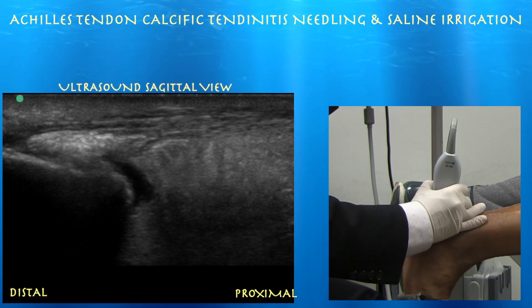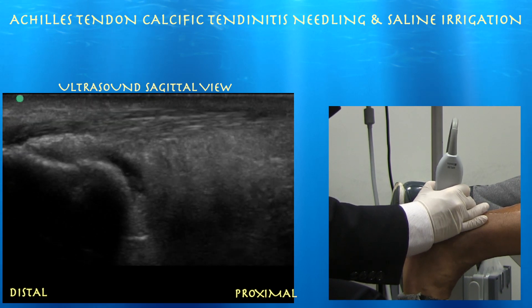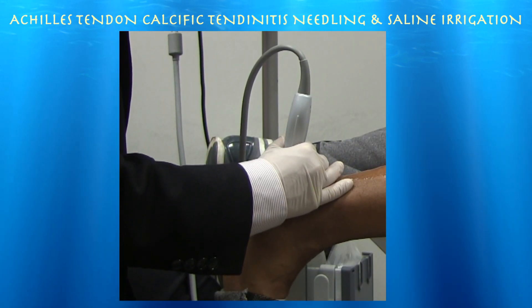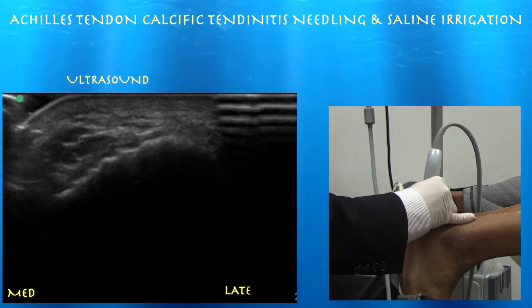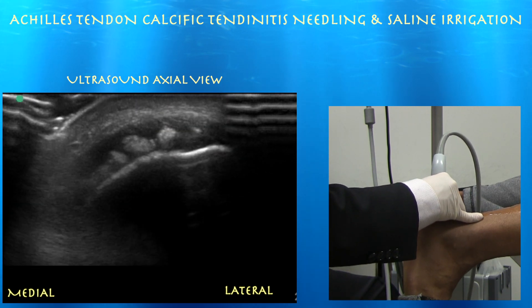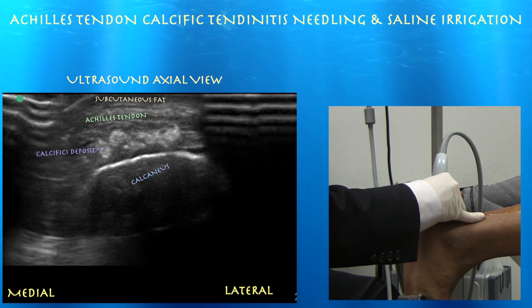Really nice view — it's just like a big calcium spot in that distal Achilles tendon. Retrocalcaneal bursitis underneath that. I think this is the main pain generator. Now we are going to do some axial views — lateral is to the right of the screen, medial is to the left. This is the calcaneus. Going proximal, you can see that huge calcific area — just a very large calcific deposit.